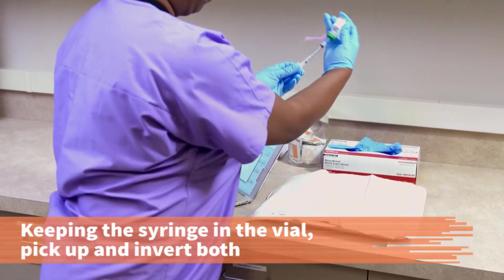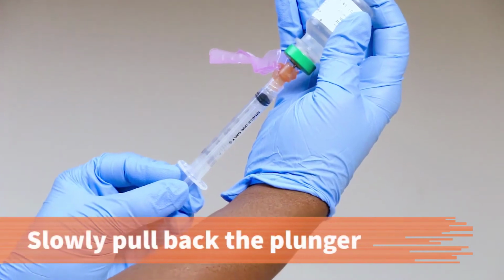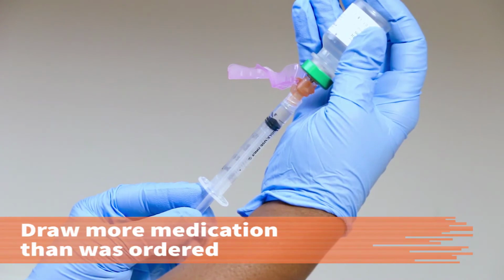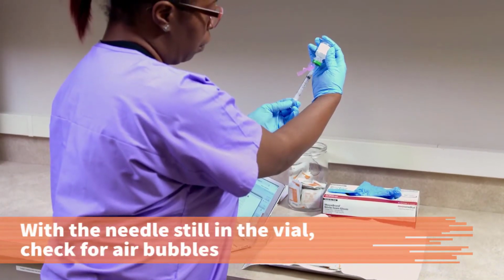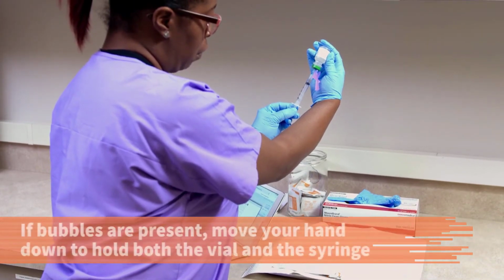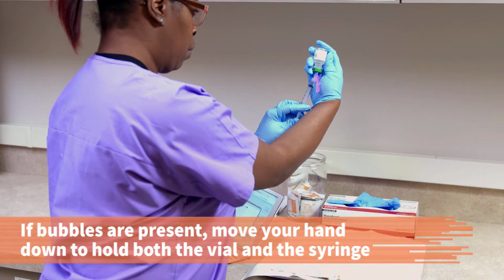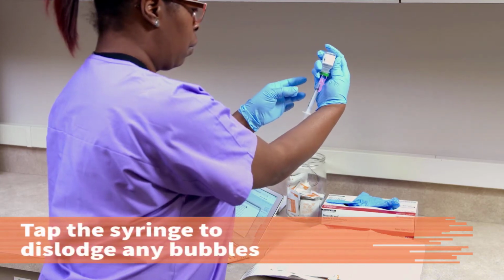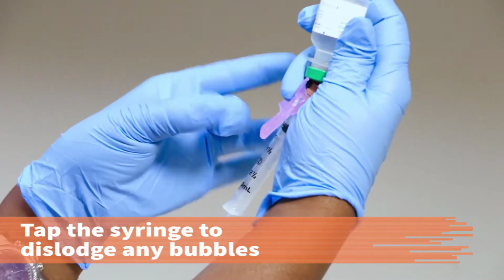Keeping the needle in the vial, pick up and invert them. Slowly pull back on the plunger with the unit at eye level and draw up more medication than ordered into the syringe unit. While the needle is still in the vial, check for air bubbles in the syringe. If air bubbles are present, move the fingers holding the vial down to grasp the vial and syringe as a single unit. With your dominant hand now free, use it to tap the syringe until the air bubbles dislodge and float into the tip of the syringe.